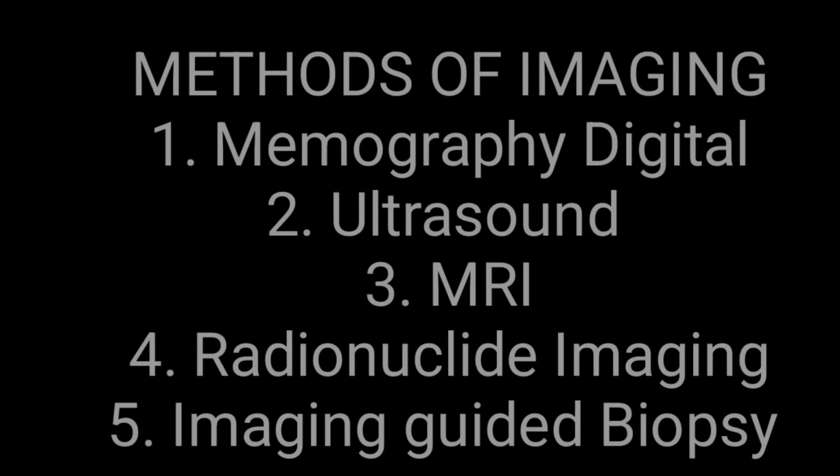used for preoperative localization, and also for confirmation of the malignant potential, to diagnose histologically whether there is a malignant cell and which type of cell these are, whether medullary carcinoma, ductal carcinoma, or papillary carcinoma. All these depend upon the imaging guided biopsy. So biopsy or FNAC, fine needle aspiration, sometimes helps to identify the malignant cells and malignant tissues.